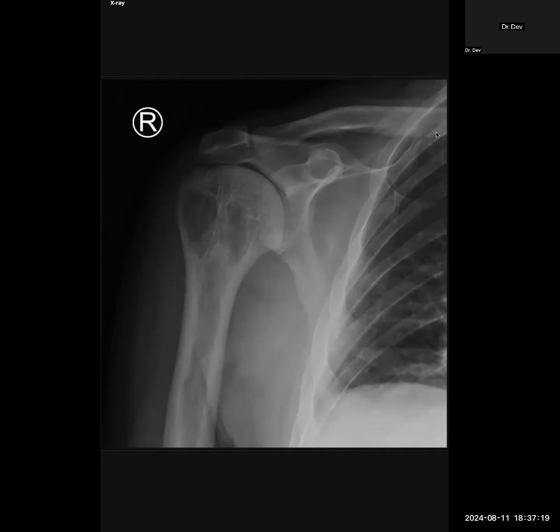Number one, when you have identified the pathology immediately, quickly looked at the other areas and haven't found anything very important, you can shorten that bit of your presentation. You can just say the lungs, the bones, the soft tissues, and the visualized part of the abdomen look normal, and finish in 10 seconds. Give yourself more time, because this is one of those typical opening cases. You hit it for a 6, finish it in 30 seconds to 1 minute, and move on. Give yourself more time for the inevitably hard cases that come next.